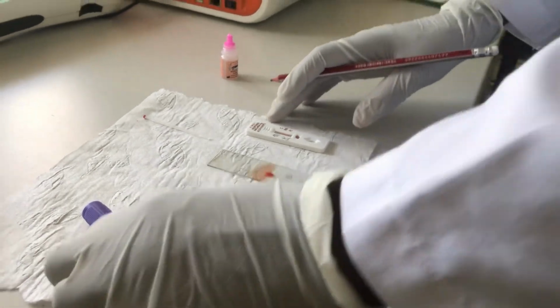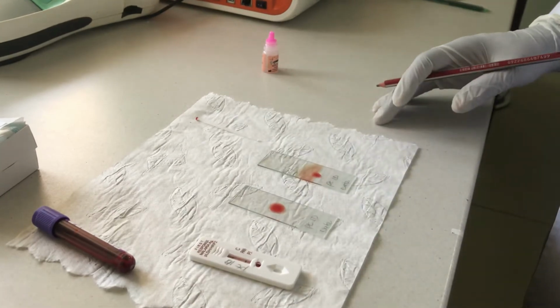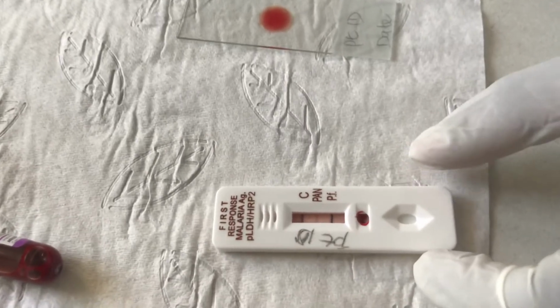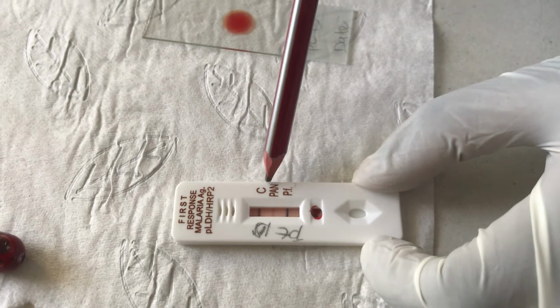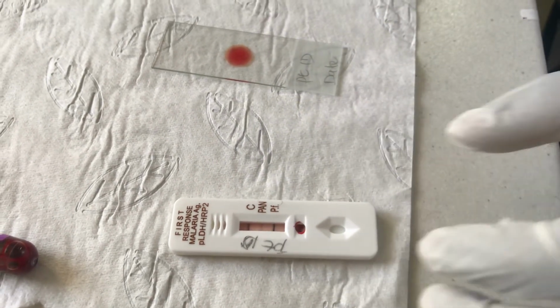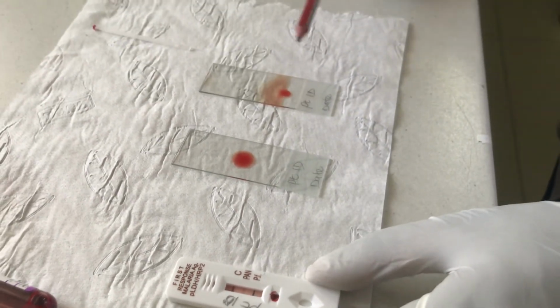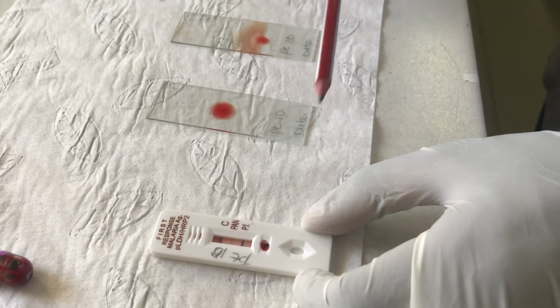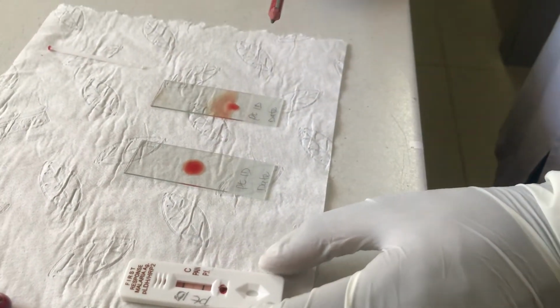So, even before the test is done, you are able to see that the rapid diagnostic test kit is already showing a reaction. At the region of PF, this is Plasmodium falciparum and the other species. At the point C, it's where the control line is supposed to appear. So when you have two lines, it indicates that it's a positive RDT. If it's a three line, it means it covers all the other species, the falciparum and the other three species, vivax, ovale, and malariae.